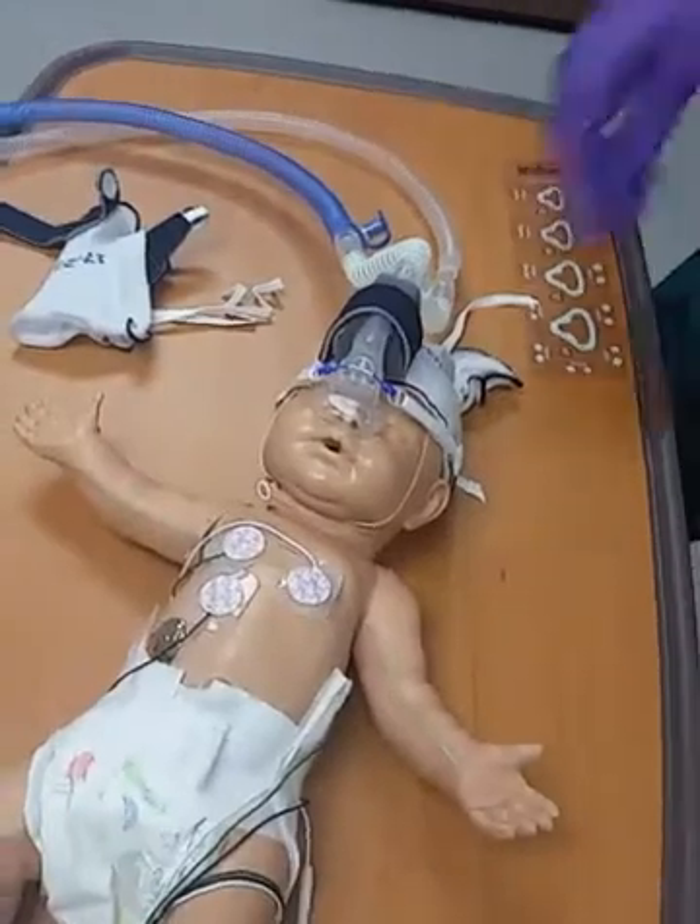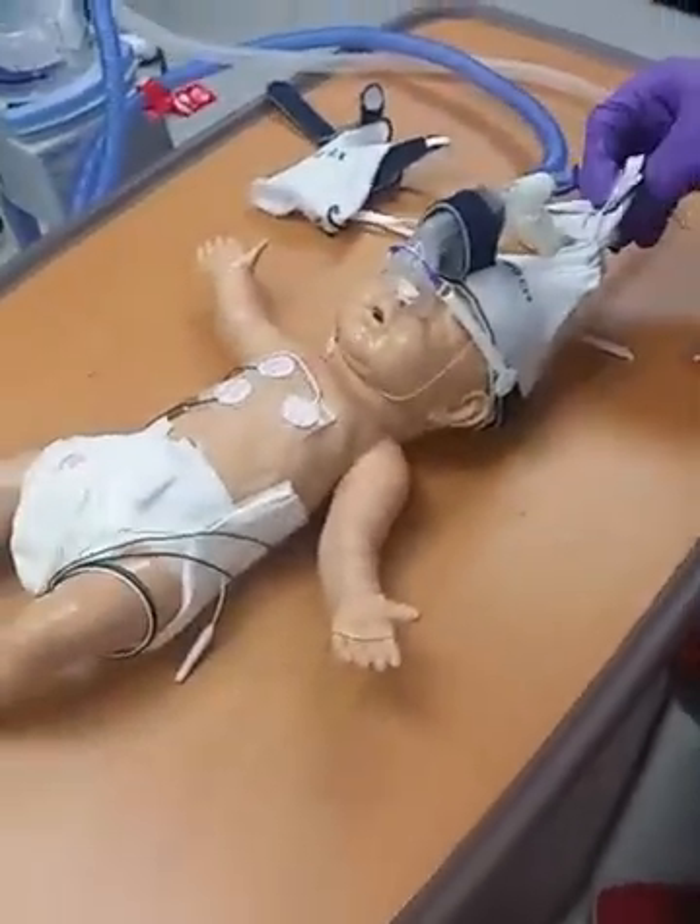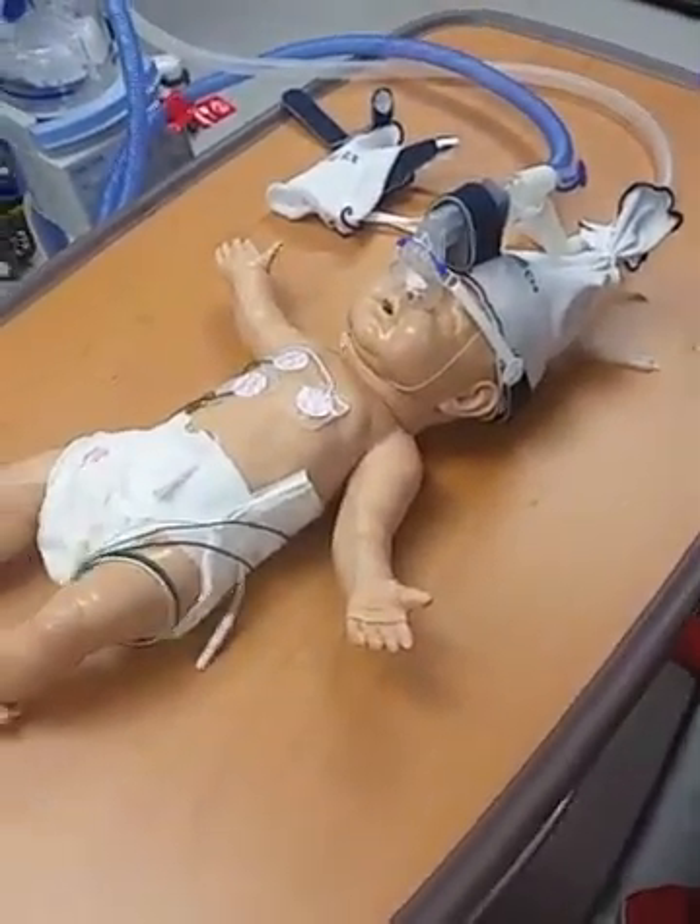But this is how it would look when it's on a patient. And then you can tie this around the head to maintain the baby's head's heat.